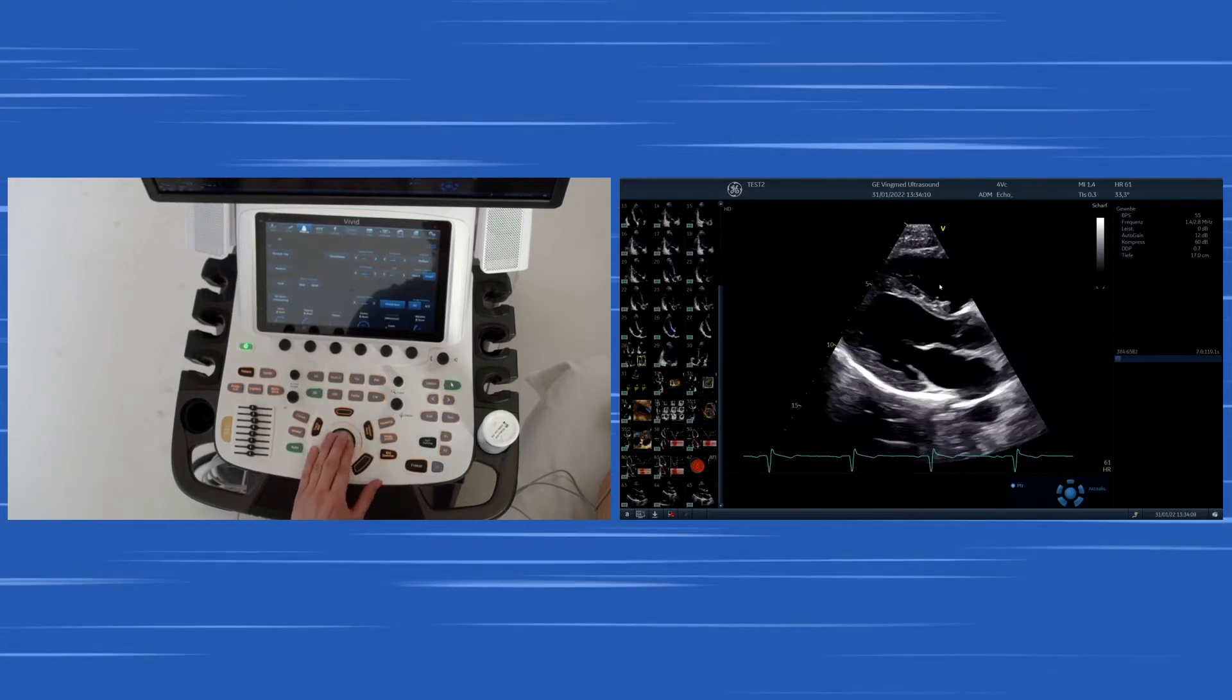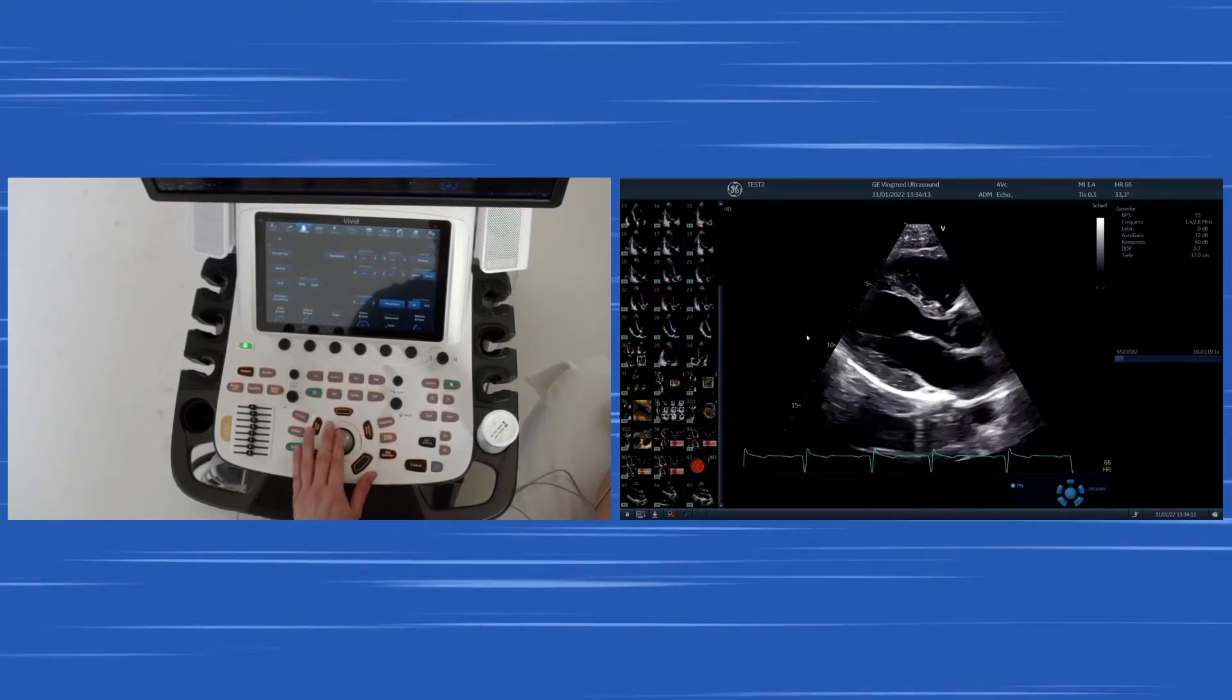What we see initially is the right ventricle, the interventricular septum, the inferolateral wall.